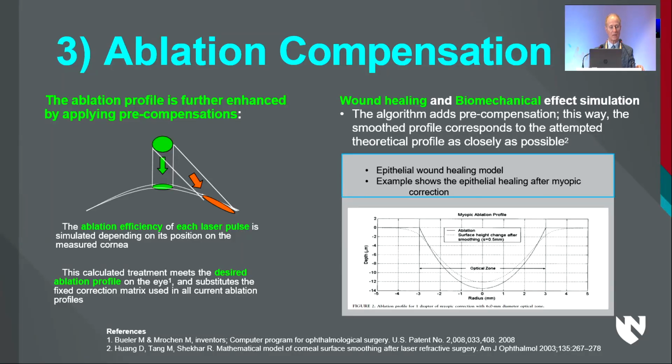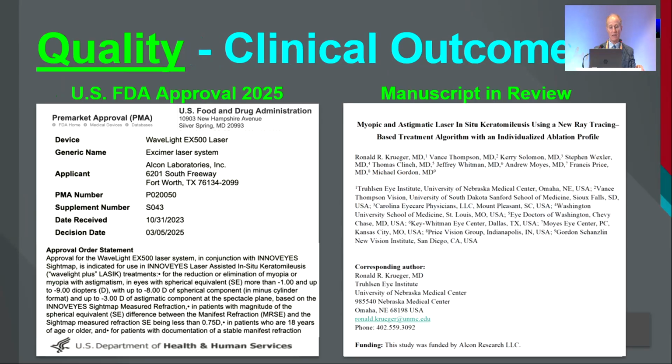There's generally losses, and this is all compensated for, as well as wound healing on the epithelium. Looking at the quality, our FDA study has finally been approved, and there were 9 centers in that FDA study, of which I was a coordinating investigator.